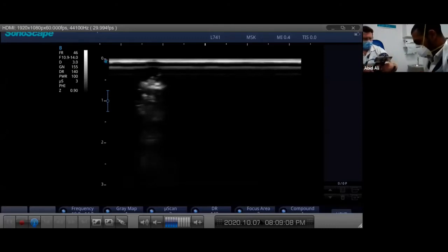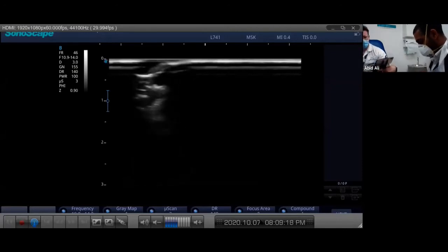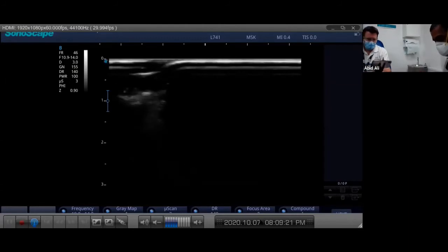So this is about the right position. I sometimes actually like the whole leg flat and the ankle hanging off the edge because I can mobilise and manipulate the foot at the same time. So I'll maybe start with that. Do you want to just relax - you look a little bit tense there as well, Adrian?